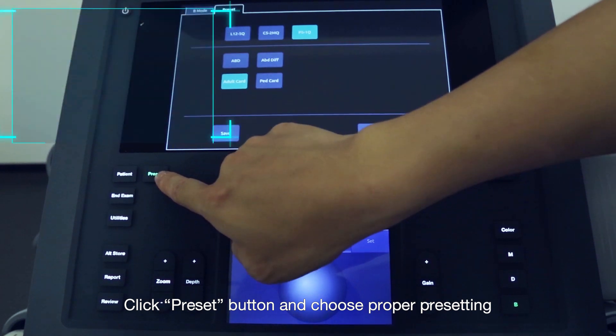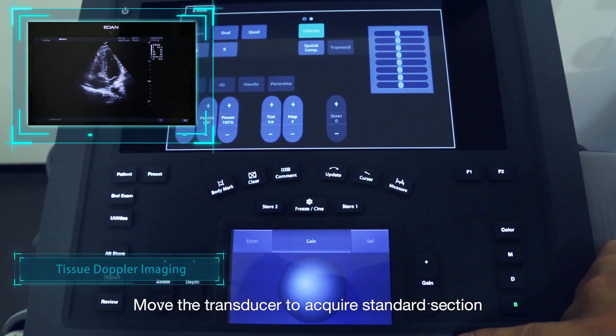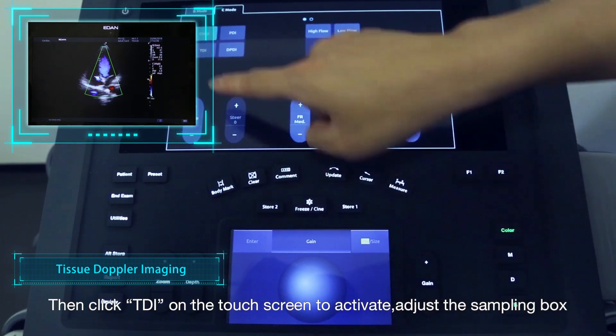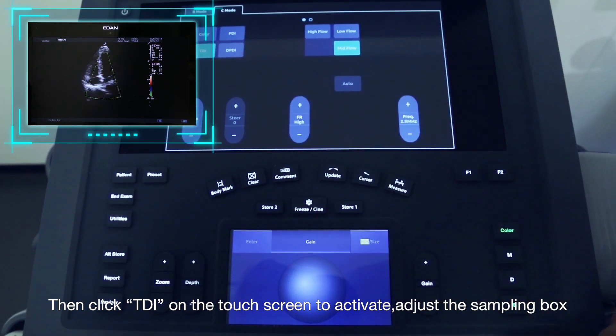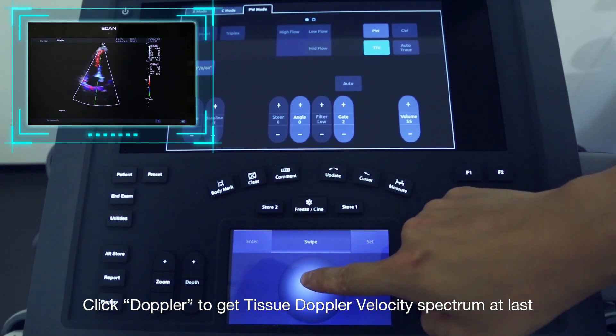Click the Preset button and choose the proper presetting. Move the transducer to acquire a standard section. Click the Color button, then click TDI on the touchscreen to activate. Adjust the sampling box. Click Doppler to get the Tissue Doppler velocity spectrum.